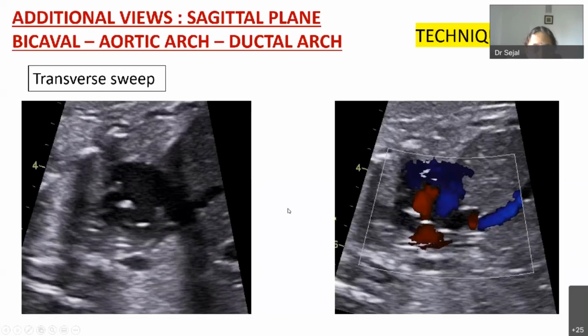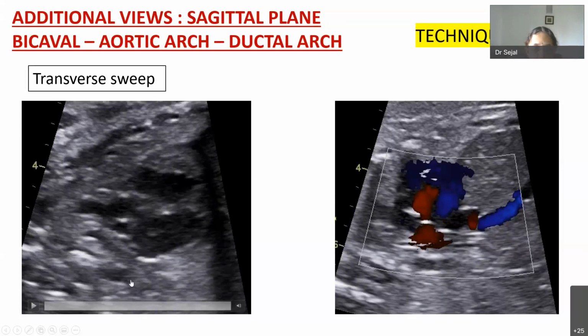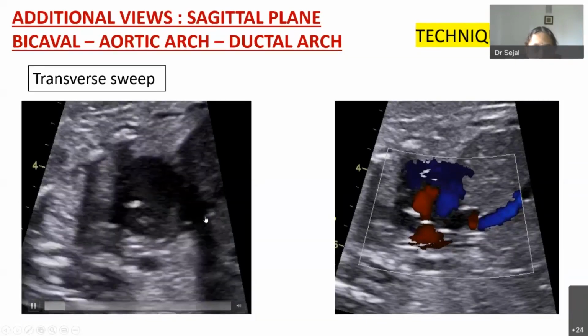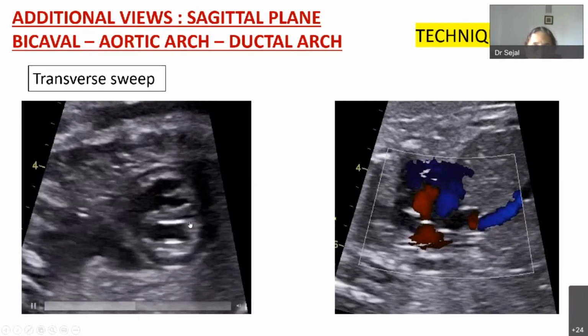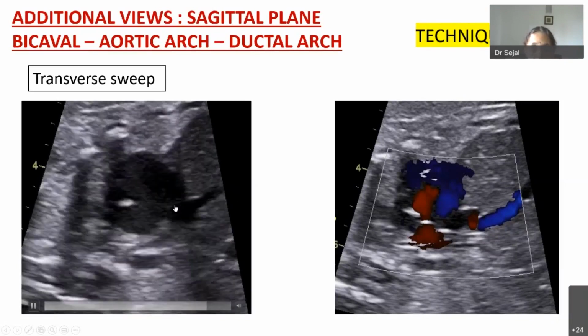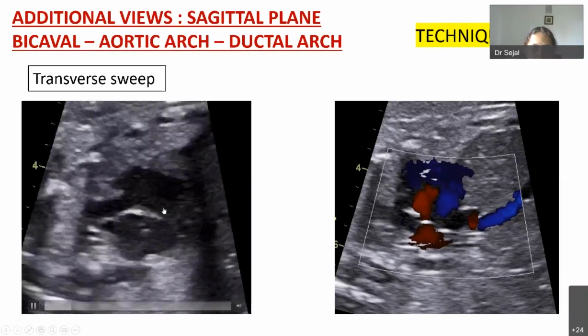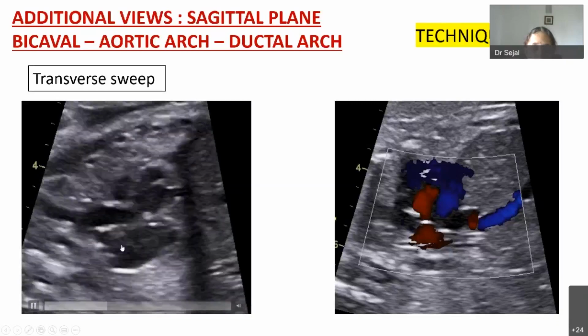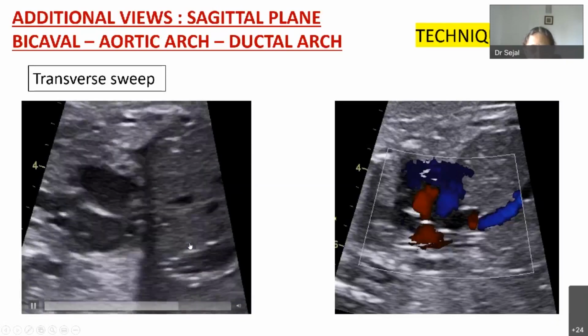This is the head. This is the abdomen. And I can see this is the IVC, hepatic veins, and SVC. So the SVC is here next to the aorta. The SVC and the IVC. Remember, the SVC IVC view is very important for a few things: to demonstrate a normal venous drainage, and an IVC which is not interrupted. In this view, you can see that this is the flap of the foramen ovale, which is towards the left atrium. The right ventricle is anterior, left ventricle is posterior.